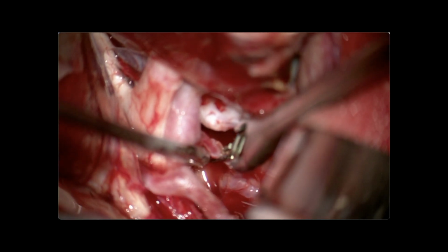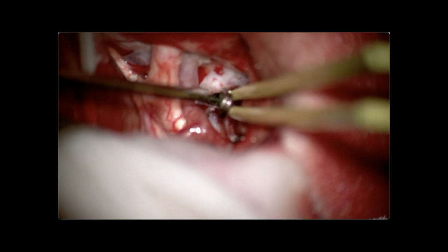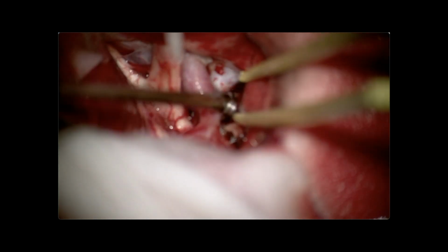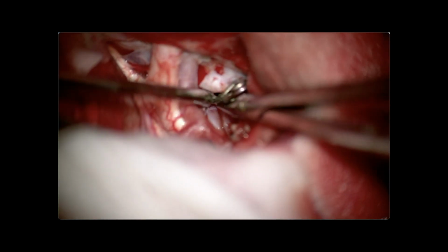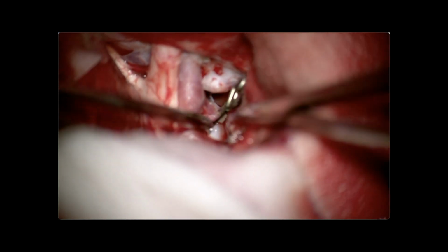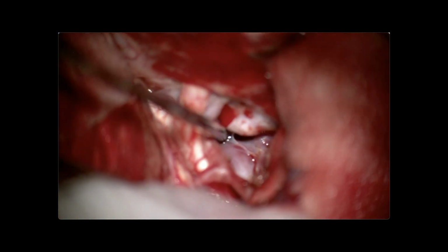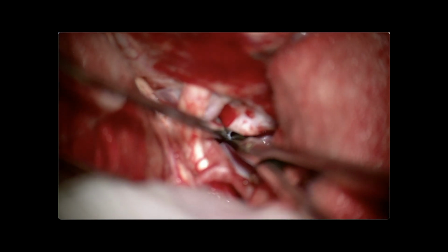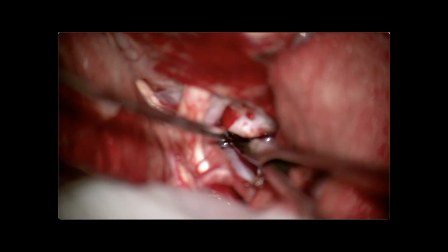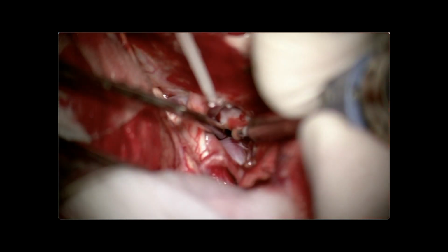To increase the retrocarotid space and the freedom of surgical manipulation, the posterior communicating artery is coagulated and divided near the P1 segment of the posterior cerebral artery. Next, sharp dissection of the arachnoid near the neck and the dome of the aneurysm is performed. Additionally, the posterior clinoid is partially resected with a 3 mm diamond burr.